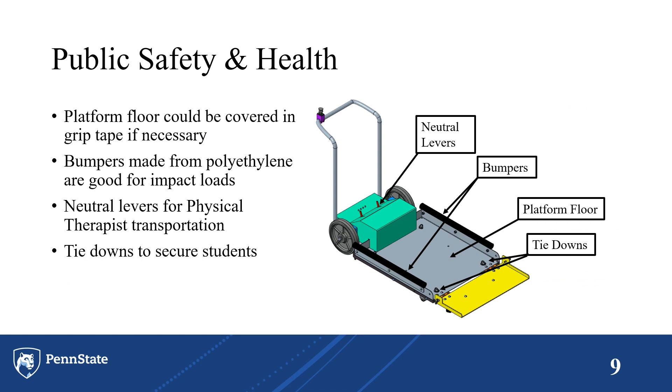For public safety and health, the platform itself can be very slippery, so the Barber Center can cover it in grip tape if necessary. It features three bumpers — one on the front and two on the sides — which are good for impact loads. There are neutral levers on the motors for easy transport, and tie-downs bolted directly to the frame to secure all students to the platform.